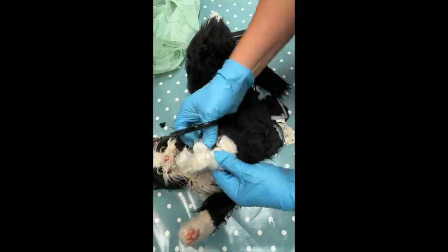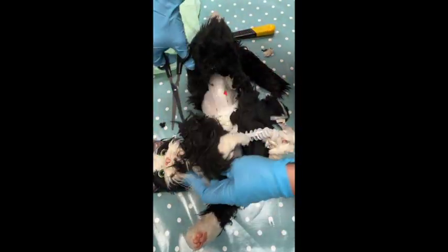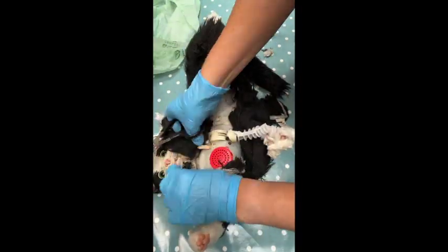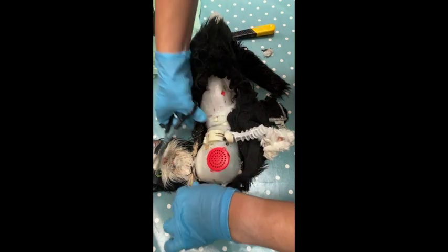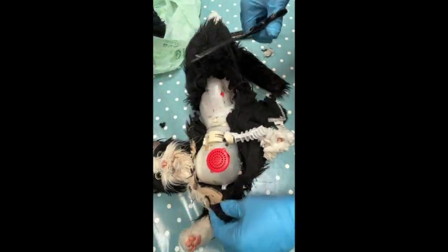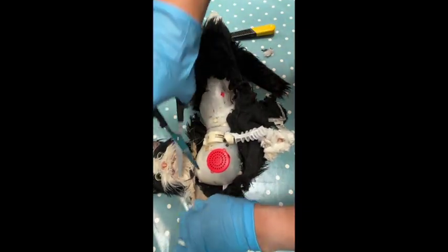It's not coming off, it's just sewn very tightly to the bottom. And then you've got the piece here, just sewing fabric into the cat here. That off. Ooh, one bit off. Oh, it really smells. Okay.